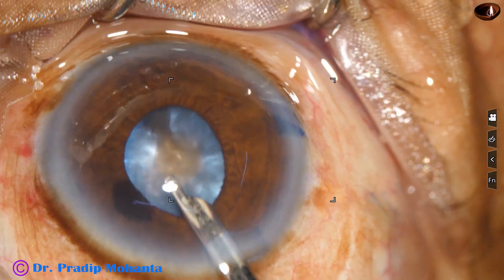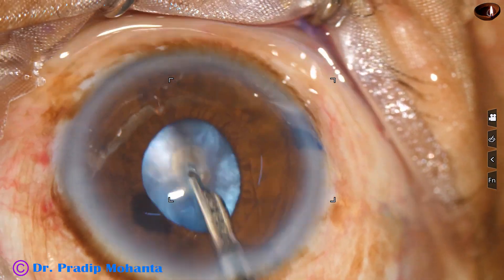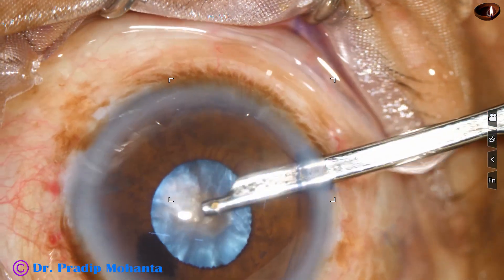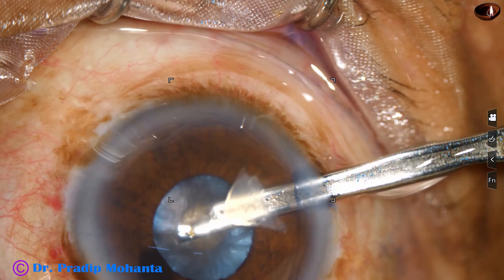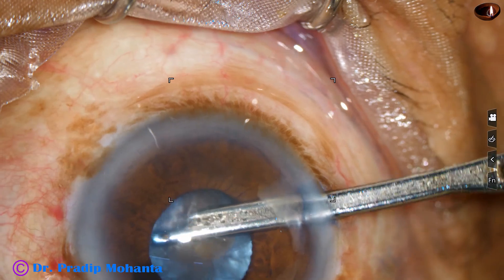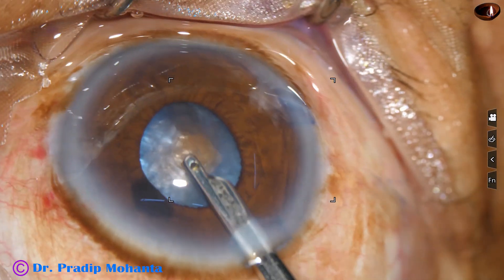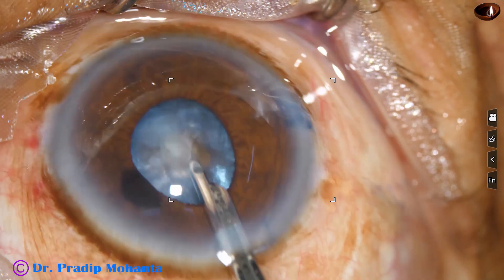It took some more time for the cortex to come out because the mini rhexis was really mini, very small. If we make the small rhexis a little larger — about one millimeter larger — then the cortex comes out easily. However, though it takes time in this case, I didn't take any chance because we have a lot of challenges to overcome.